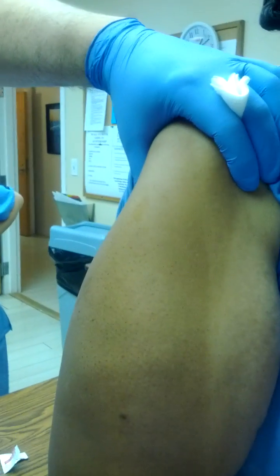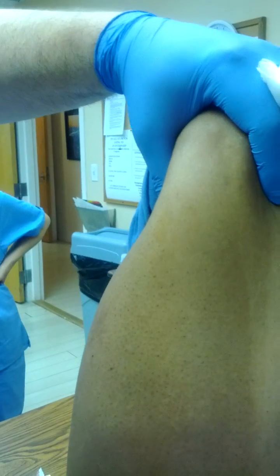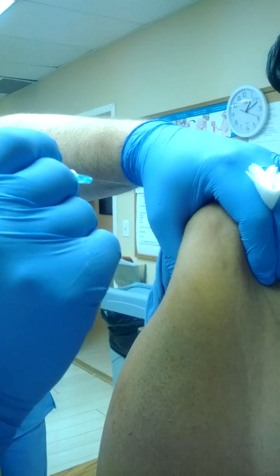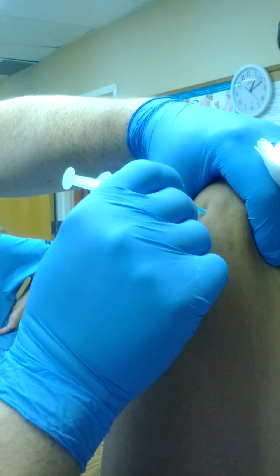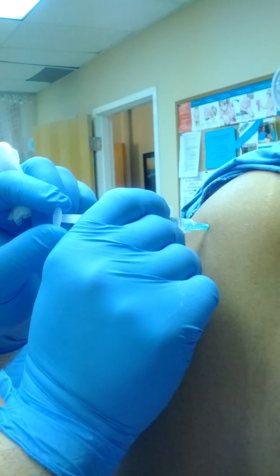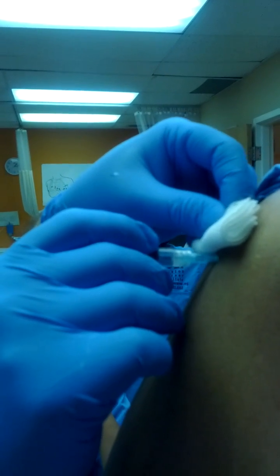I know approximately where I am. Now at this moment in time I'm going to squeeze her arm just like so. The harder I squeeze, the less pain the patient actually feels — so this is the only thing that they're feeling. And then using my speed, I'm going to poke her with a needle. Notice she didn't even flinch. The needle's already inside. I'm going to take my left hand off and gently pull back on the plunger — this gives me the ability to see if there's any blood coming into the syringe. There should not be any blood. Then I'm going to inject very slowly. My gauze is already here, I'm going to gently place it over the site of the injection, quickly extract the needle just like so, and massage the area.